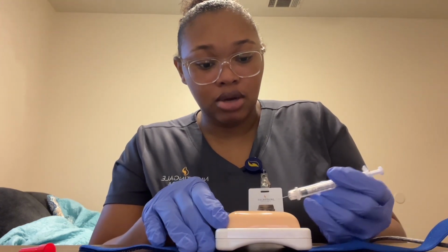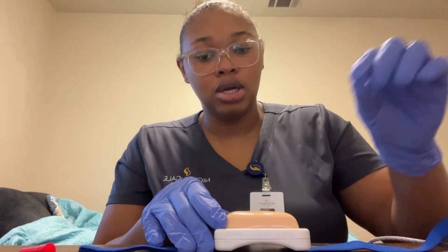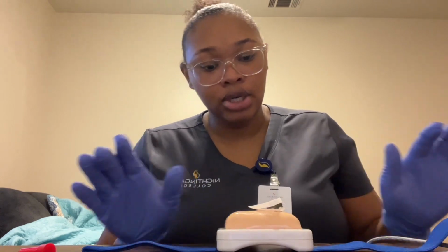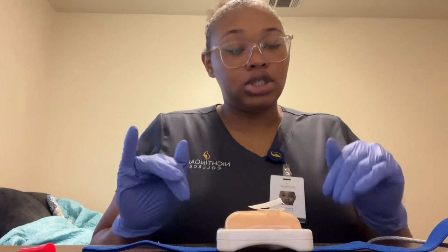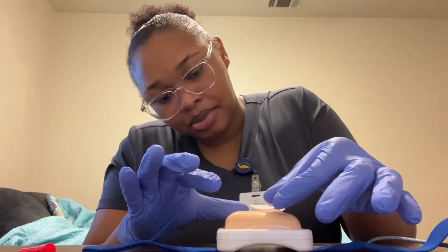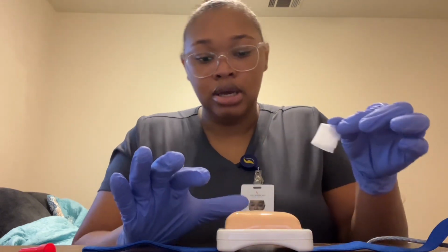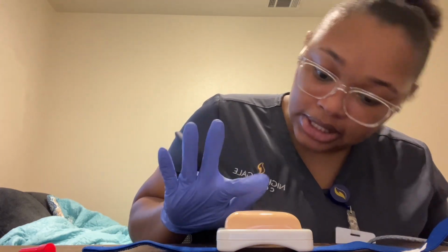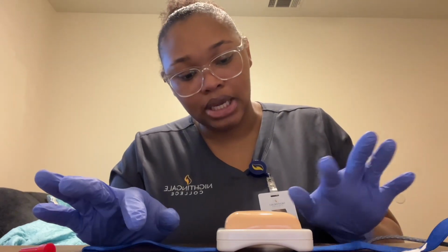You're going to take it out and put the needle into the sharps container. You're going to get an alcohol wipe and place it over the site. You do not want to massage the site. You're just putting the alcohol pad there to soak up any blood if there was any blood. My patient is not bleeding. My patient does not need a bandage. There is a 6 to 10 millimeter bleb. It kind of resembles a mosquito bite.